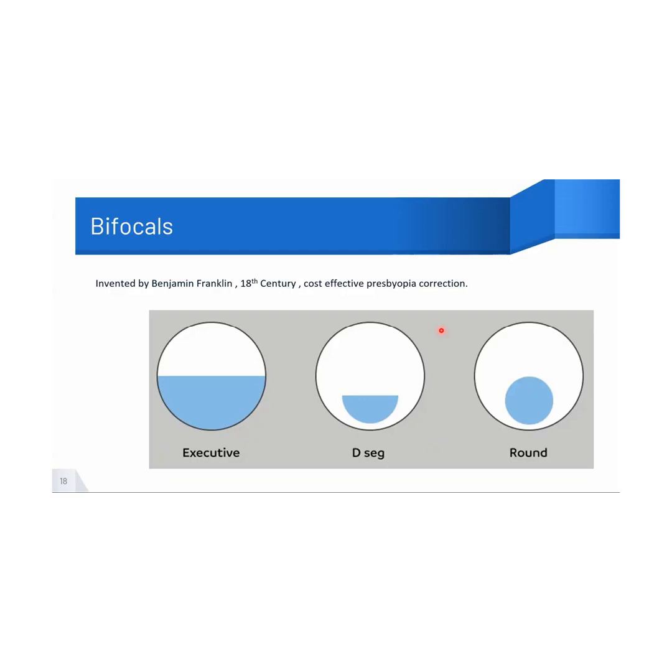Okay, so keep this as a simple rule. Definitely, if your distance is going to be myopic and then you have addition, then the prismatic effect changes. Sometimes it cancels and the image jump changes. If your distance is going to be hyperopic, it changes. But the general rule that you have to keep in mind is optic center of distance zone and optic center of near zone. If the space between these two optic centers is longer, then that particular bifocal is going to have higher image jump.